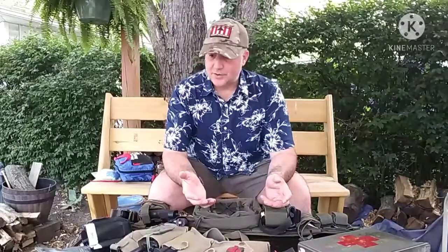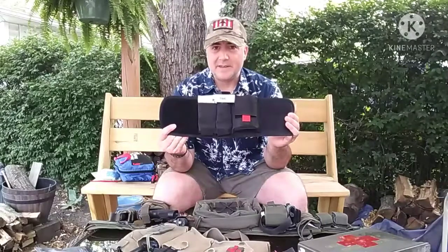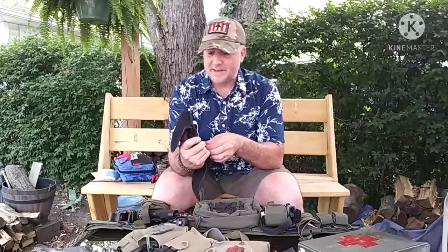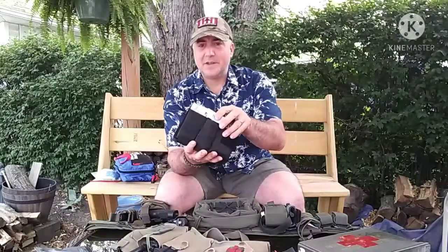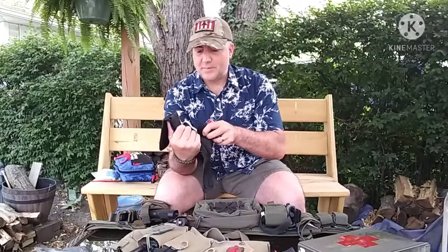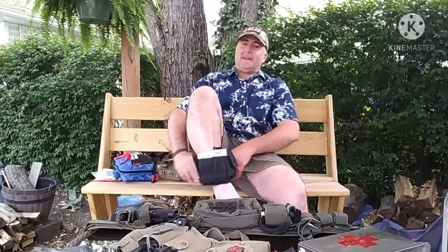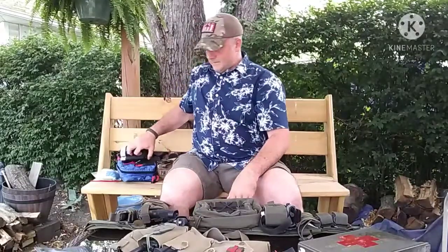And then you get into more specialized kits. If you're somebody who has a concealed carry license, and you everyday carry, something like I carry this ankle trauma kit, which just has your basics of an Israeli bandage. You have a clotting sponge, tourniquet, just your pure basics there for carrying on a leg. You have that level of care.